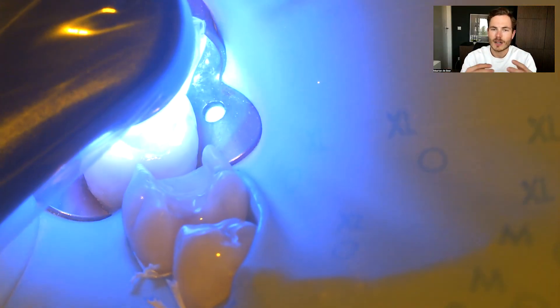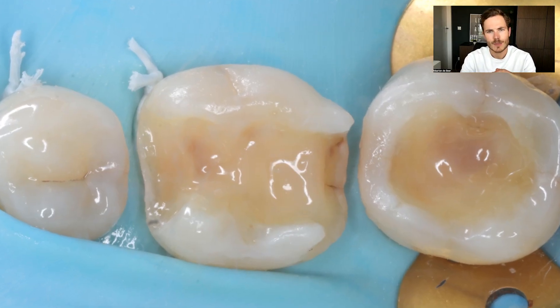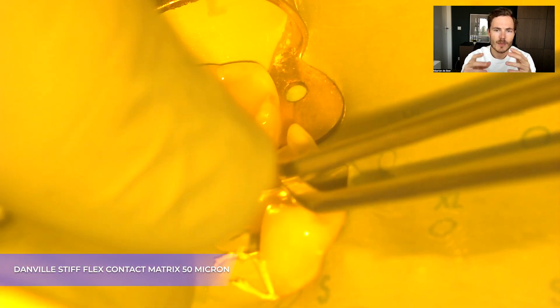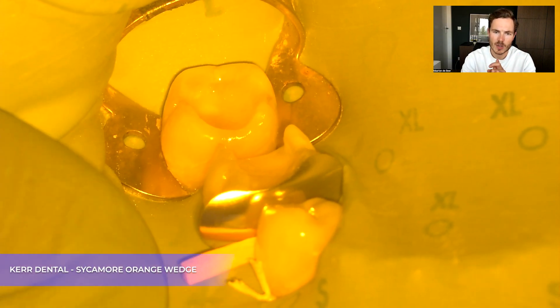What I usually do is take a look at a tooth and ask: what's missing? Is there a missing buccal cusp, a lingual cusp, or something else? Do we have a small lesion on the mesial or distal? I will always restore that before going back to a class one restoration.